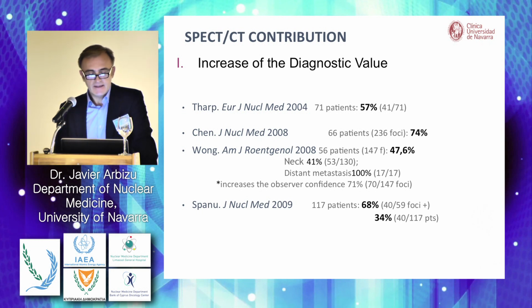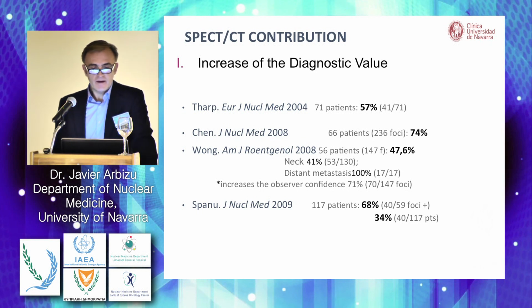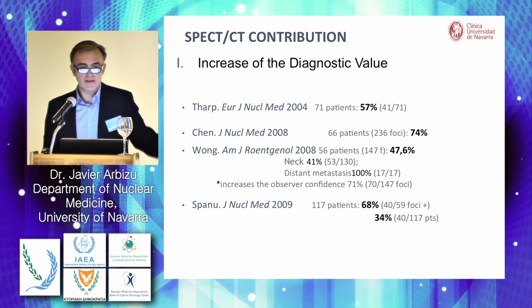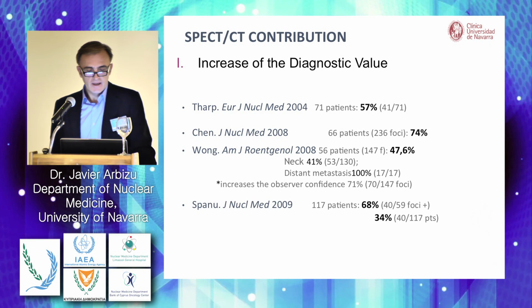And in the last one, with a great amount of patients, they found an increase in the diagnostic value in terms of positive foci of 68%, and in terms of patients, 34% of patients had an increased diagnostic value using SPECT-CT instead of just the traditional whole body scan.